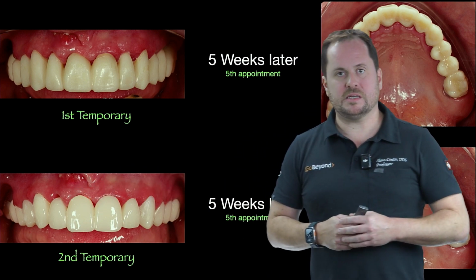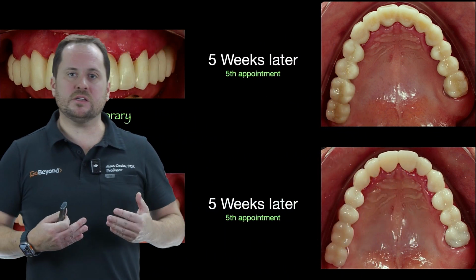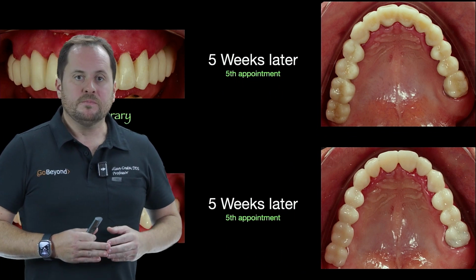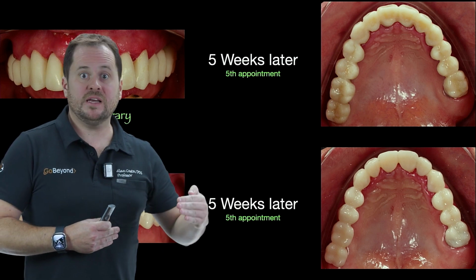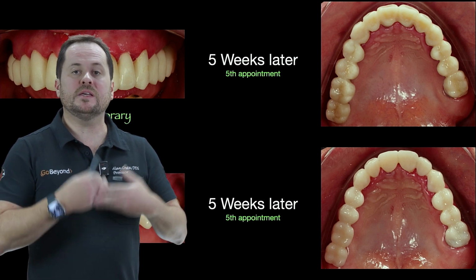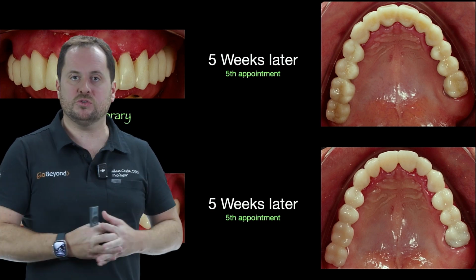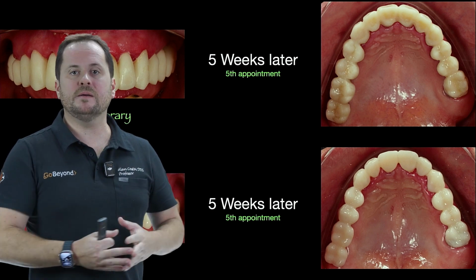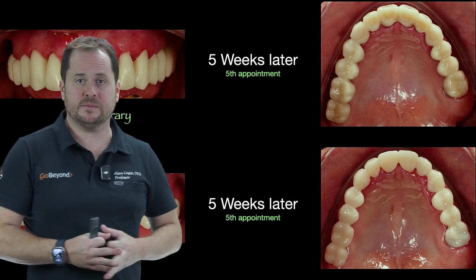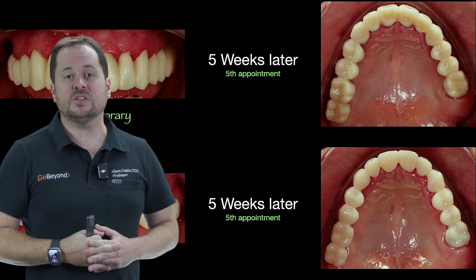So when we work with these temporaries, we feel much more comfortable making several sets because you become very concerned about the cost issue. We are all indeed very, very concerned about the cost issue. Wow, I will have to make a temporary set, then I will have to make another one, and maybe later still make another one. But I haven't even done the surgery on the patient yet. I haven't even made the provisional implants. Yes, folks, it's necessary because of this conditioning issue, Gildeval. Imagine you arrive at the patient's surgery and you're already with the provisionals on the implants. That's when things start to get expensive if you keep doing trial and error in your patient's planning and the provisionals on the implant.